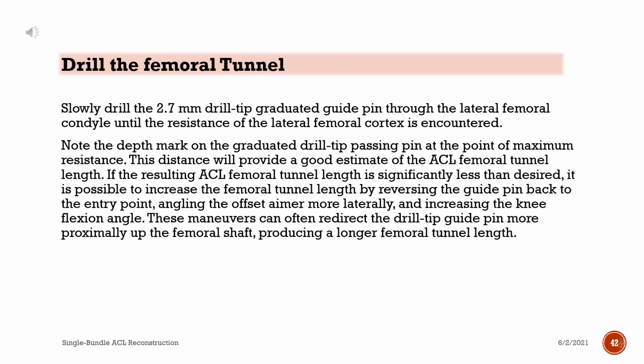Drill the femoral tunnel. Slowly drill the 2.7 mm drill tip graduated guide pin through the lateral femoral condyle until the resistance of the lateral femoral cortex is encountered. Note the depth mark on the graduated drill tip passing pin at the point of maximum resistance. This distance will provide a good estimate of the ACL femoral tunnel length.